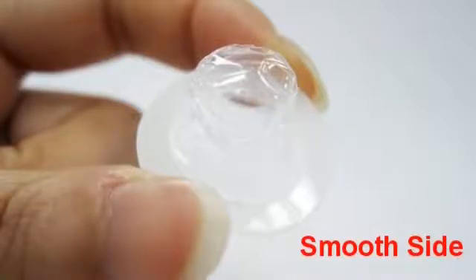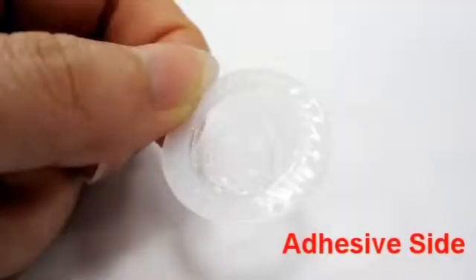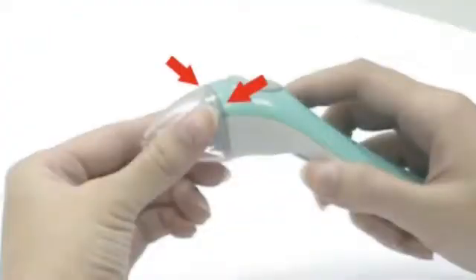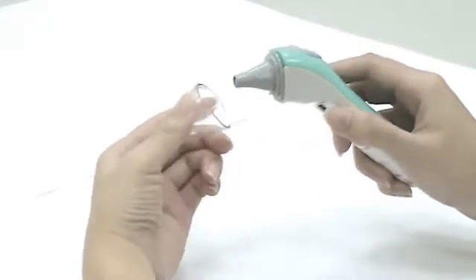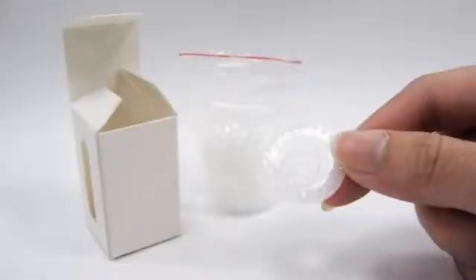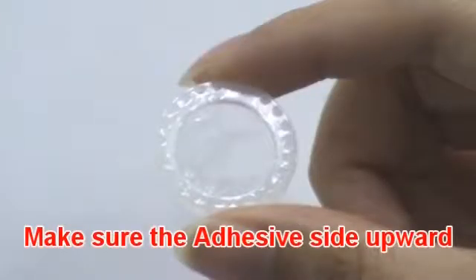The probe cover has a smooth side and an adhesive side. Gently squeeze the opposite ends of the thermometer to pull off the probe cap. Use a new and undamaged probe cover. Make sure the adhesive side is upward.